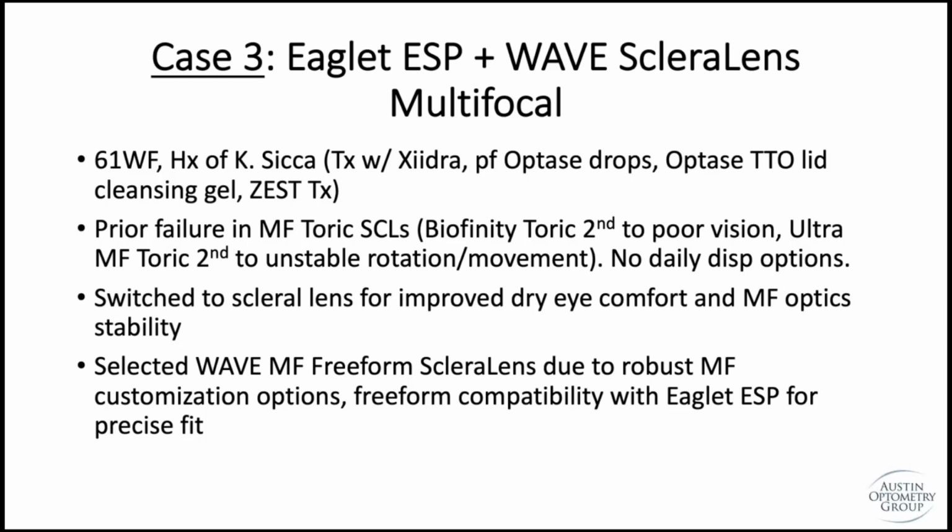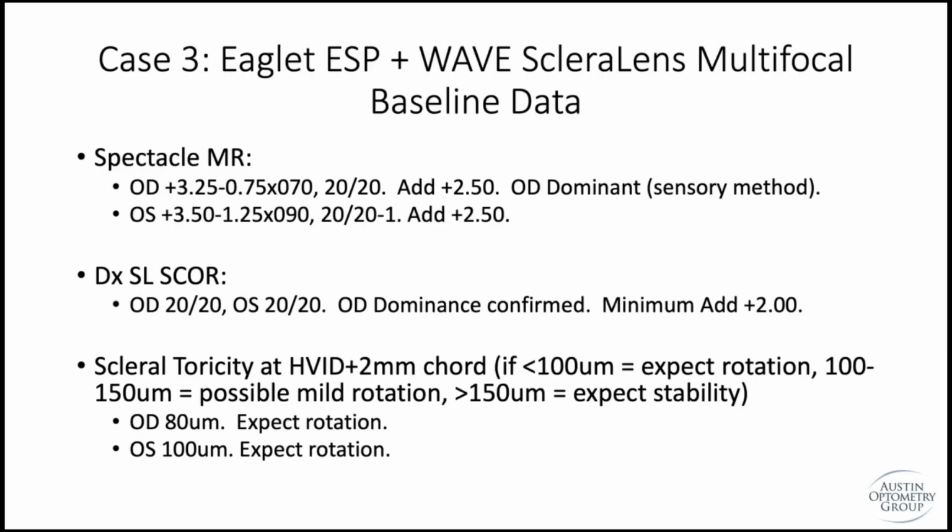All right, we're going to transition back to the Eaglet, and this time more to a quote unquote regular cornea. Dry eye patient, failed in previous multifocal toric lenses, not a candidate for daily disposables just based on what's available. And really just wanted better comfort from a dry standpoint, but with good optics. As everybody knows, Wave makes fantastic multifocals. I wanted to see how this case would come out in a ScleraLens.